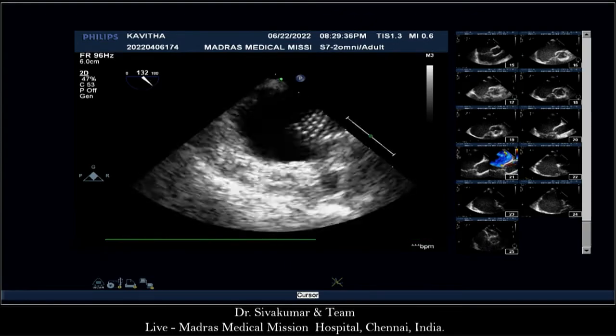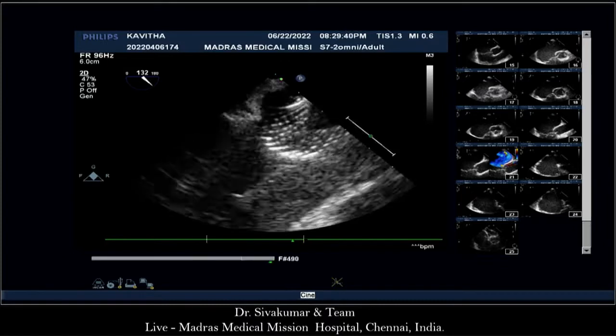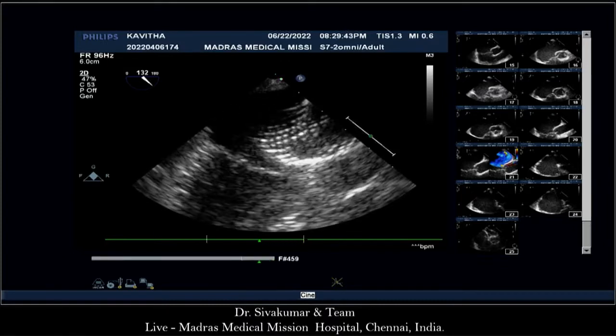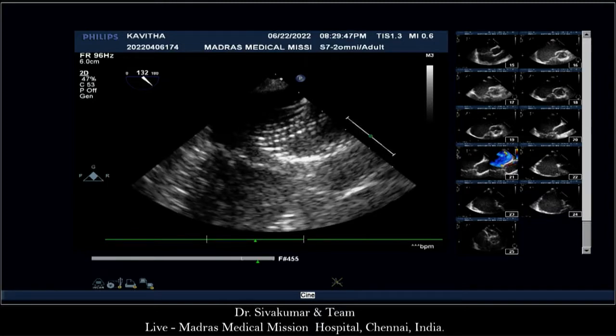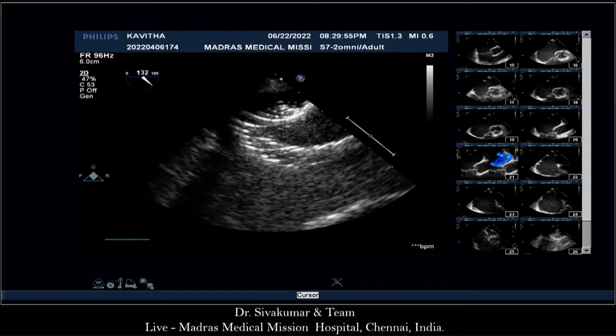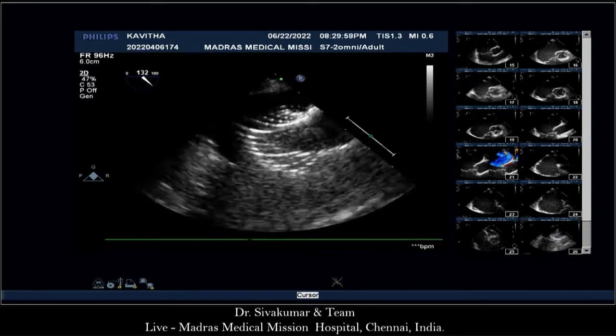Yeah, I do see it, but remember the excursion of the mitral valve. The mitral valve annulus is about 29, 30 in an adult, right? So the excursion of the mitral valve, that part that sits by the atrial septum, is pretty big. You are looking at one area. You have no idea. That's why people have mitral valve perforation 6 months later, and they show you the echo, and it's not touching it, but it's perforated because you never looked at the whole excursion.